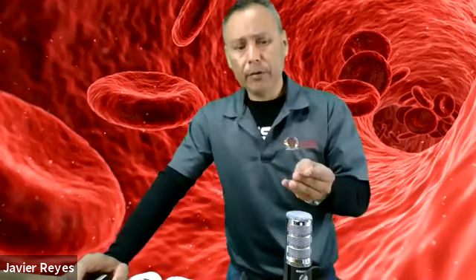How do you select the area for capillary blood collections on adults and children? Who can you collect from? Children usually over 1 year, you can collect a capillary finger stick. Remember that safety is important, so make sure you grasp more than 2 fingers on a child, preferably three fingers, so that you don't injure the child. Remember, it's always in the distal area of the fingers, which would be the ends of the fingers, the meaty or fleshy part. Those are going to be your sites to collect a sample.